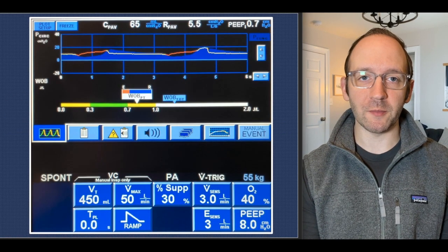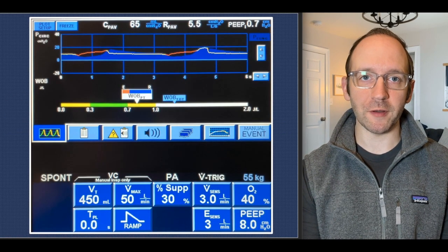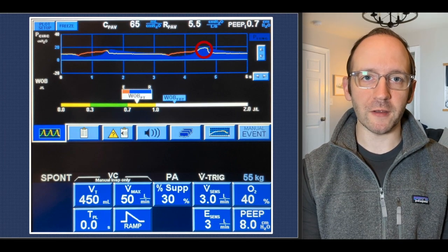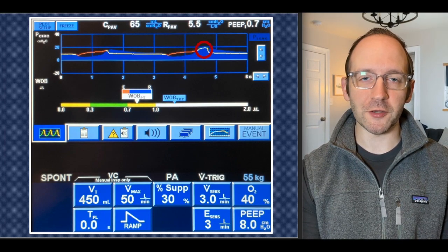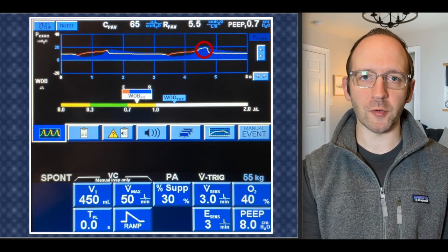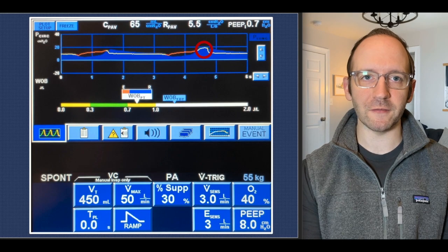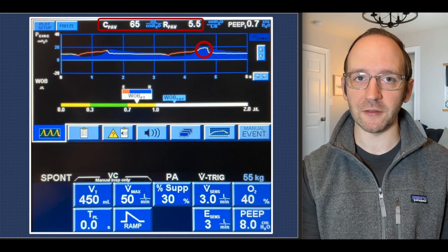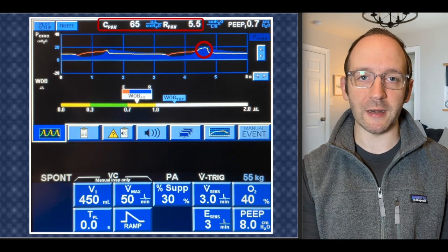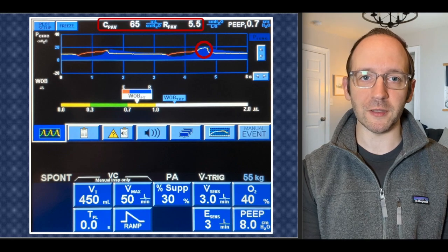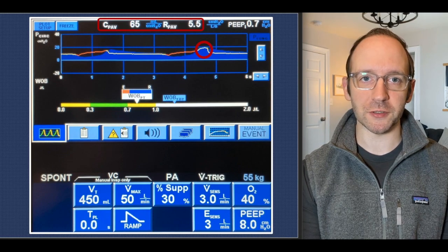Here's an example PAV screen on the Puritan Bennett 840 ventilator. You can see there's a pause at the end of inspiration that occurs about every six or so breaths, allowing the ventilator to calculate both the compliance and the resistance — values needed to complete the equation of motion.